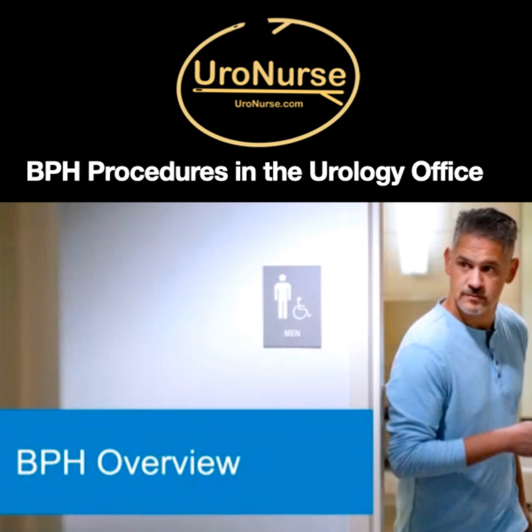So we watched those short videos, and I'm not going to belabor the point with these studies, but essentially what we're showing you here is that the IPSS scores drop dramatically. The Qmax, how the force of stream works, quality of life improves. Erectile function is minimally impacted, and really there is no impact. This is probably just the degradation that one would expect with age.